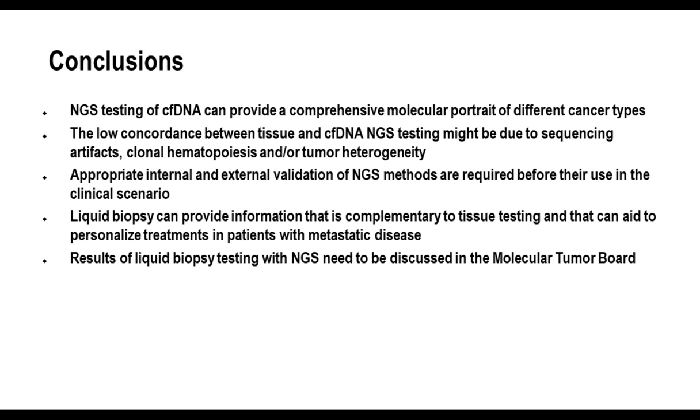And I go now to my conclusion. I think that I showed you data demonstrating that NGS testing of cell-free DNA can provide a comprehensive molecular portrait of different cancer types.